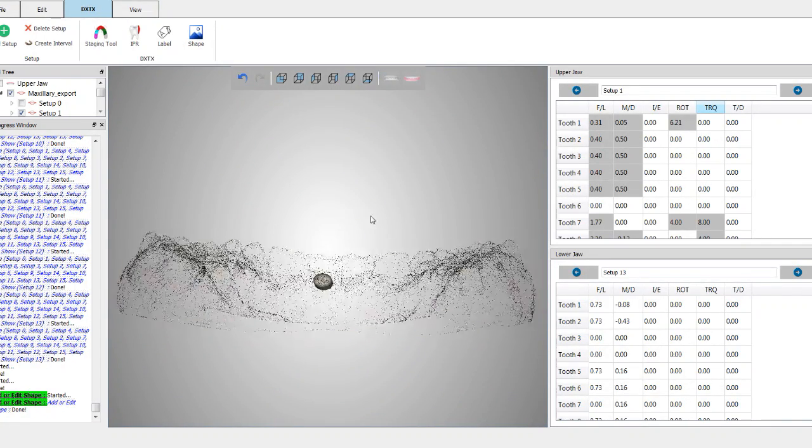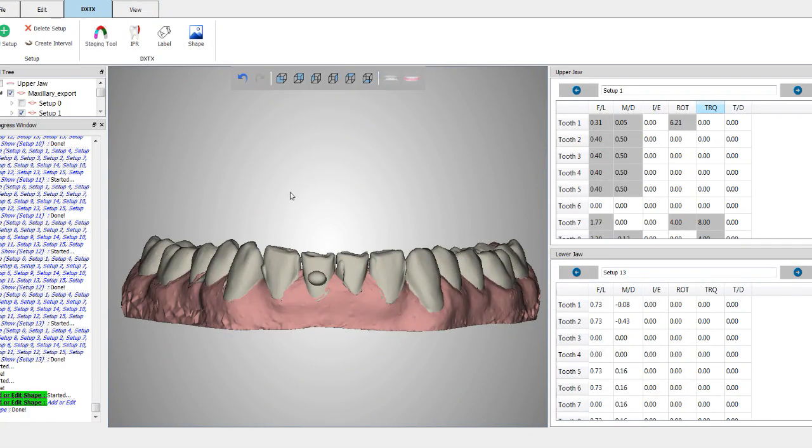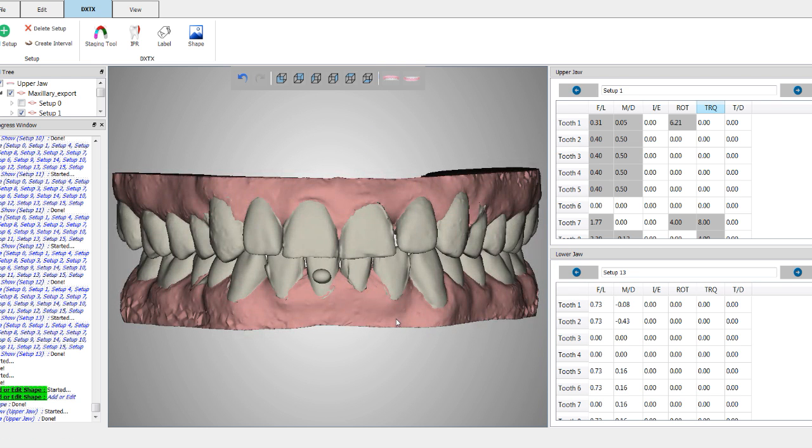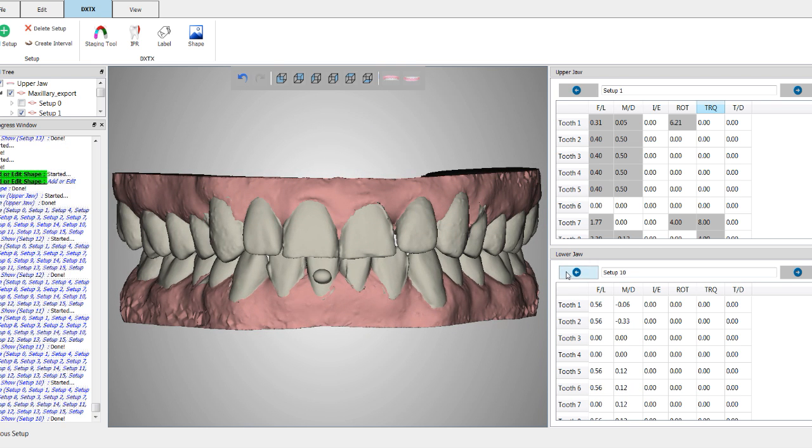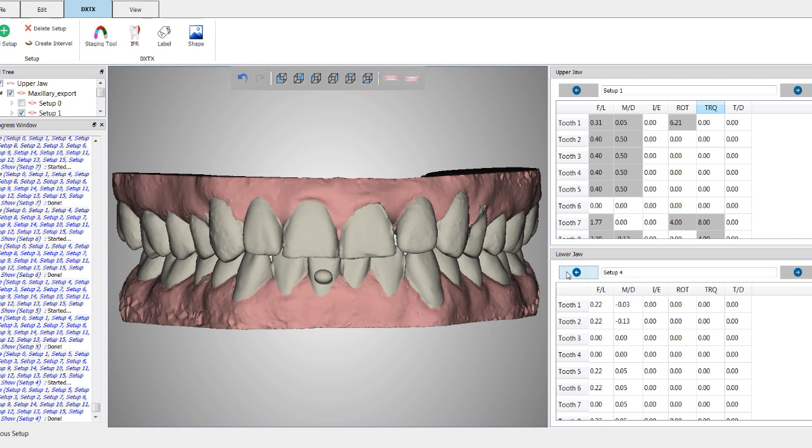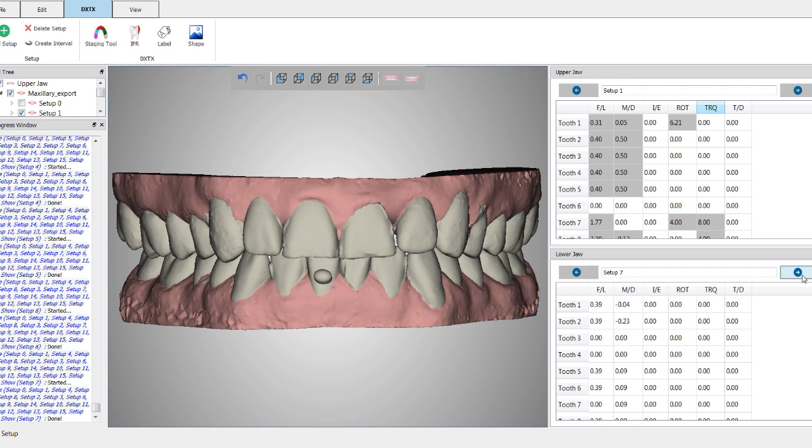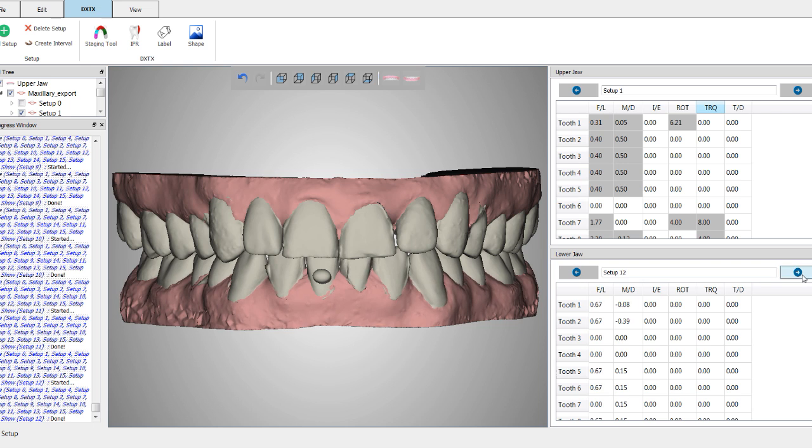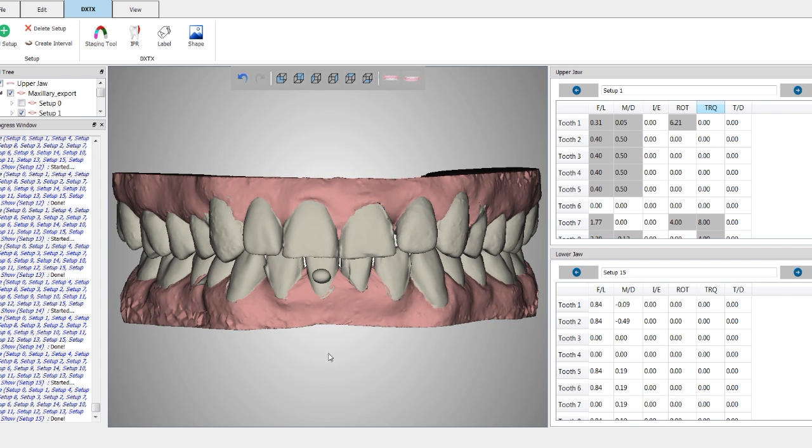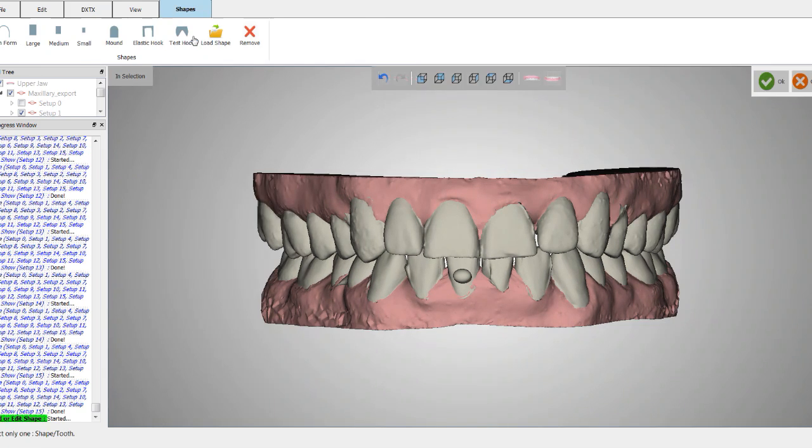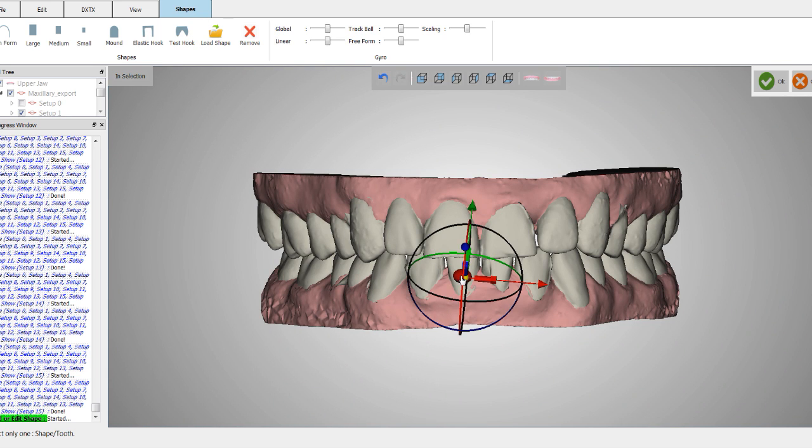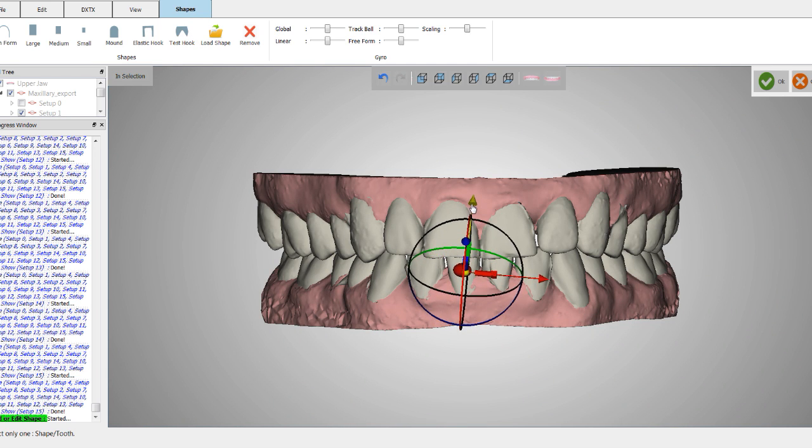And then now I have the attachment positioned on that tooth how I'd like. I always like to check the before beginning and the final, to make sure that I don't have the attachment in the patient's occlusion. If I do, you simply go back into the shape tool, click on the attachment, and then you can reposition the attachment really wherever you would like.